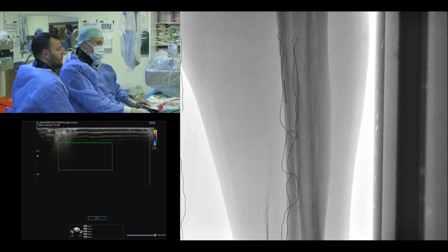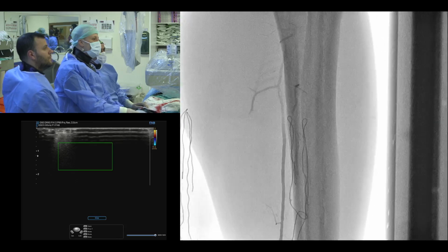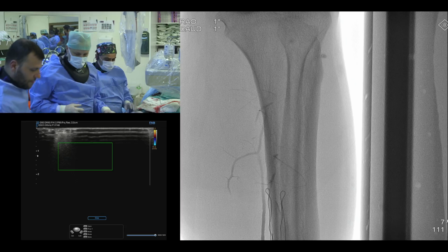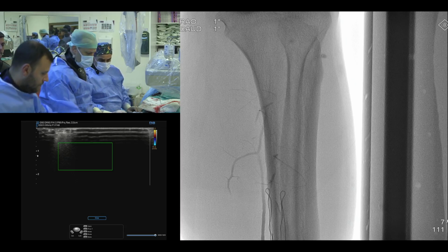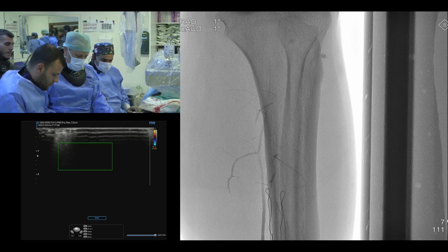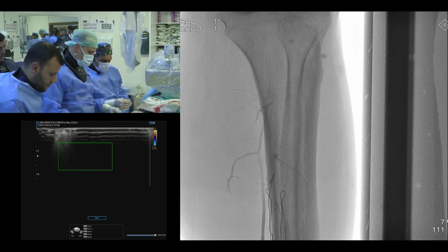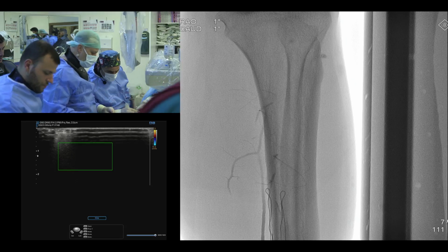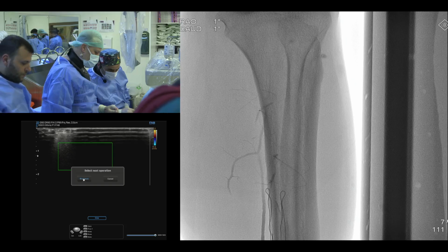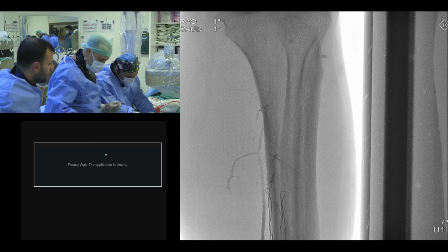Follow it upward. Okay, good. Ersan abi, can I ask a question? We know you are a very dedicated and expert operator for below-the-knee lesions. When you puncture from the transpedal region, after sheath insertion, do you give any nitrates to prevent spasm? Yes, correct, like radial sheath insertion.